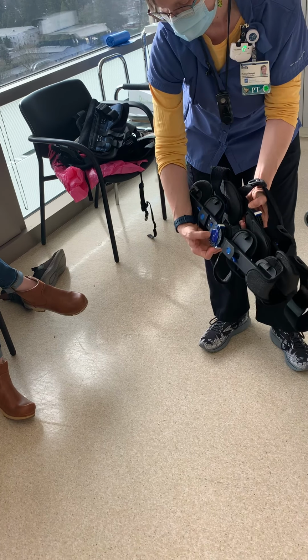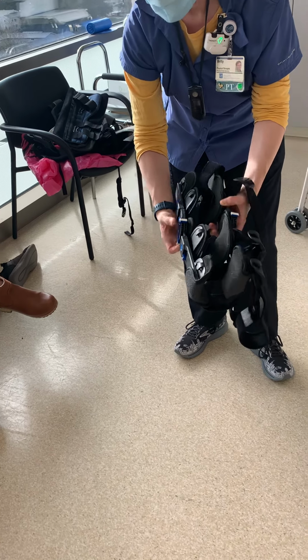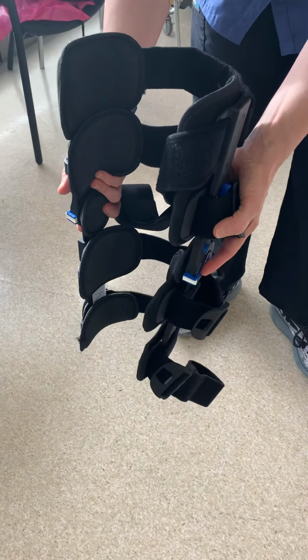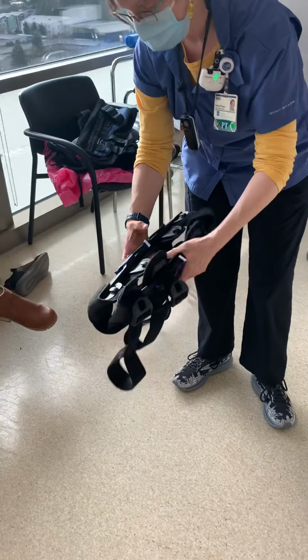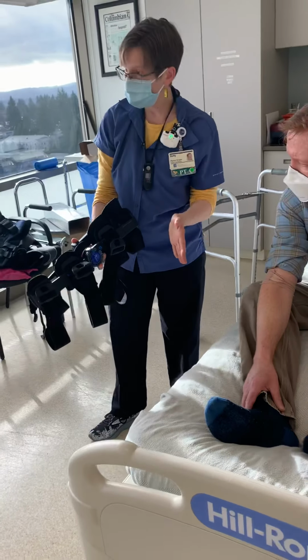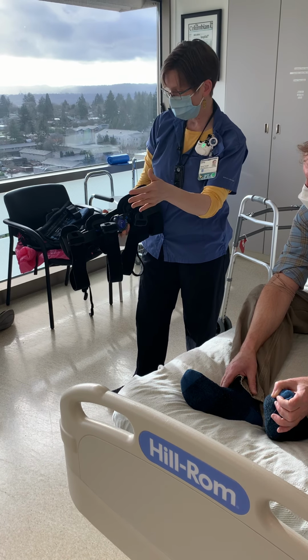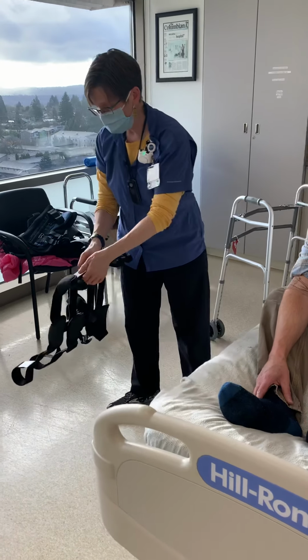These hinges right here, the dials, line up with the knee. There's a smaller end here, which is the ankle end, and the thigh piece is a little bit thicker up top. This is really nice because it fits somebody really short to somebody fairly tall. I believe they told us it was 4'8" clear up to 6'4". So you can actually extend these out.